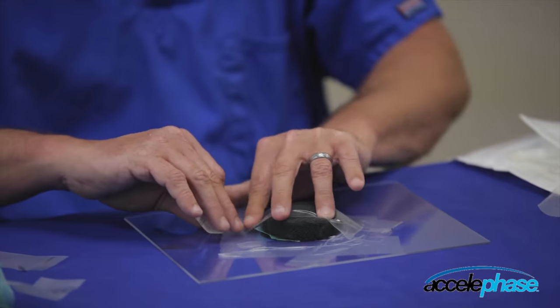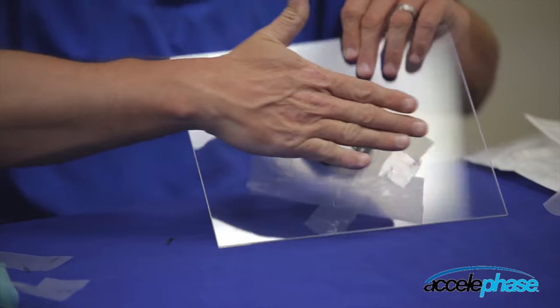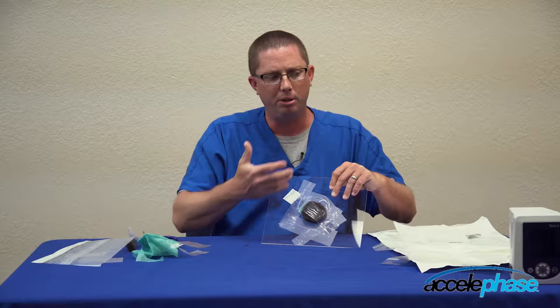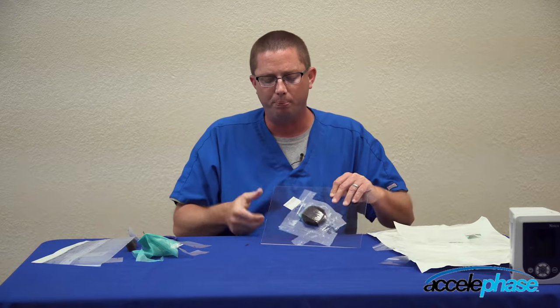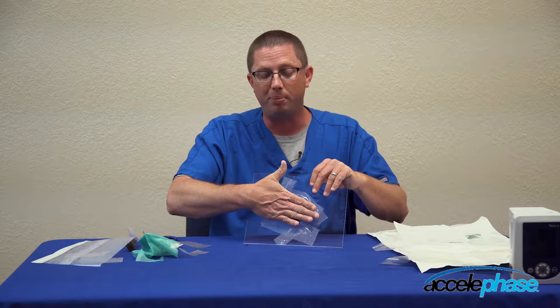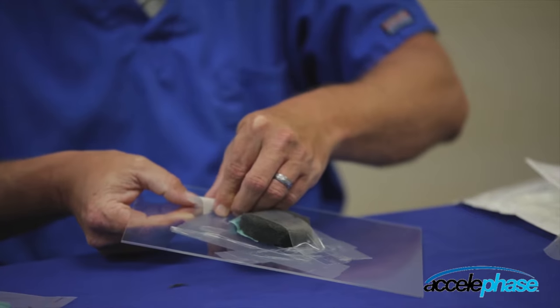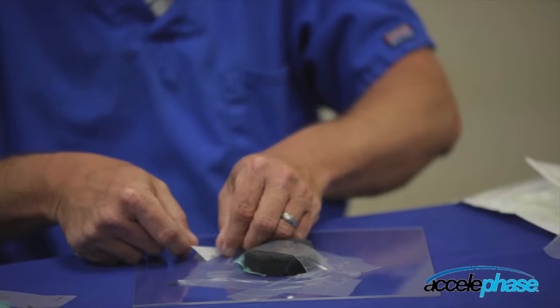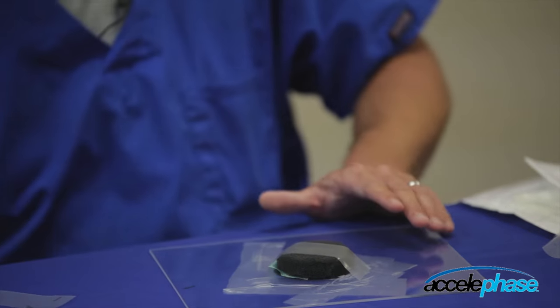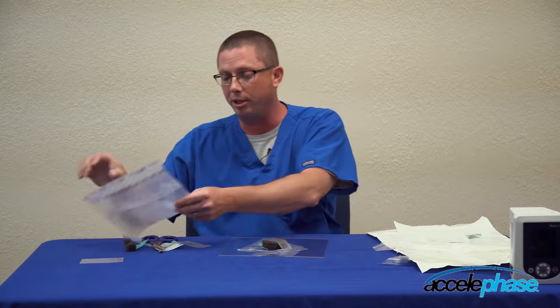I'm going to cover this, keeping it all intact, and apply my foam. When applying the drape over the top, do not compress the foam. The negative pressure device will compress the foam — all that can cause is pain and discomfort to the patient. Remove number three, pull the tab, then continue covering the entire wound base.